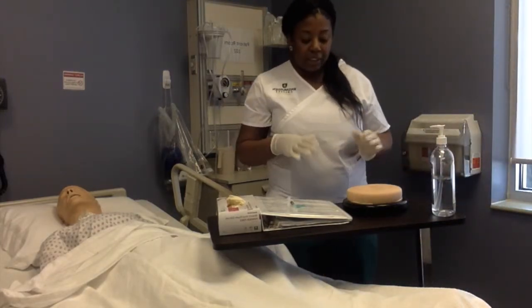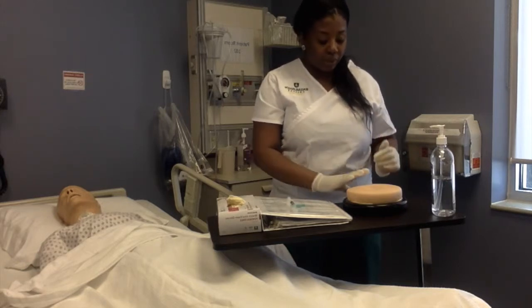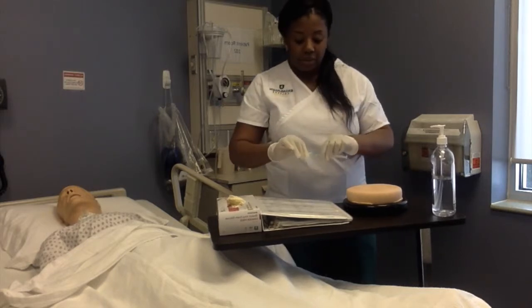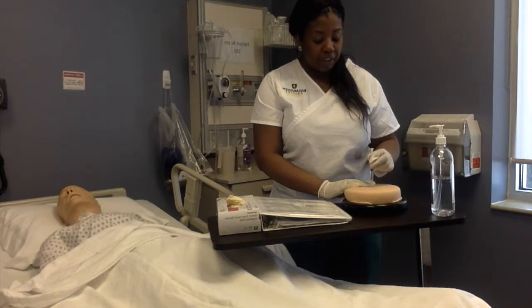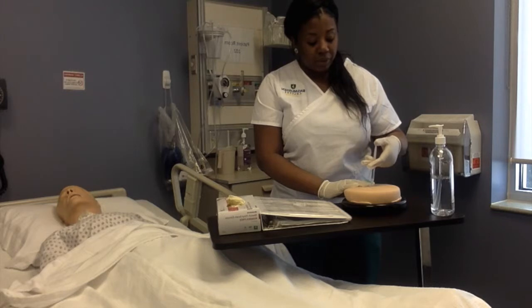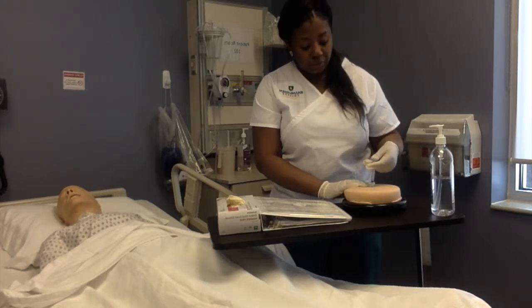And it is going to be an intramuscular injection, which I will be using a Z-Track form to do so. So I'm going to pull back the skin. Excuse me. I want to pull back the skin to do a Z-Track, and I want to go in at a 90-degree angle. Before I inject, I want to aspirate the needle to make sure that there is no blood, and I will inject the medication at about 10 seconds per mil, so about 20 seconds. So 18, 19, 20. There we go.